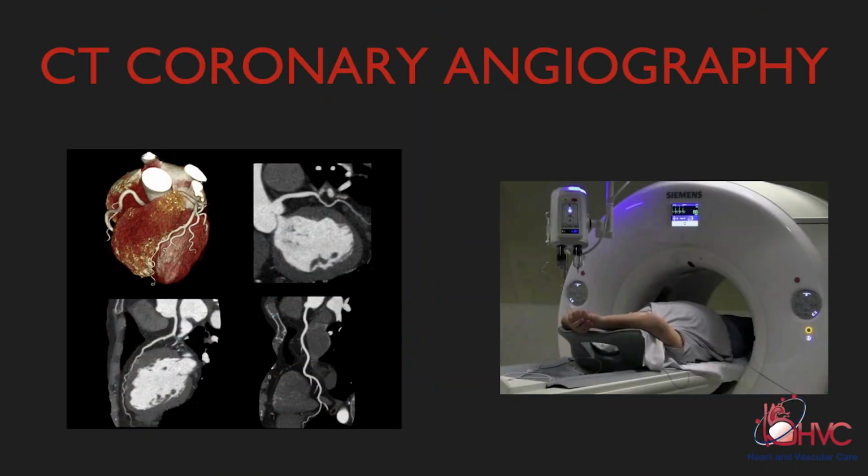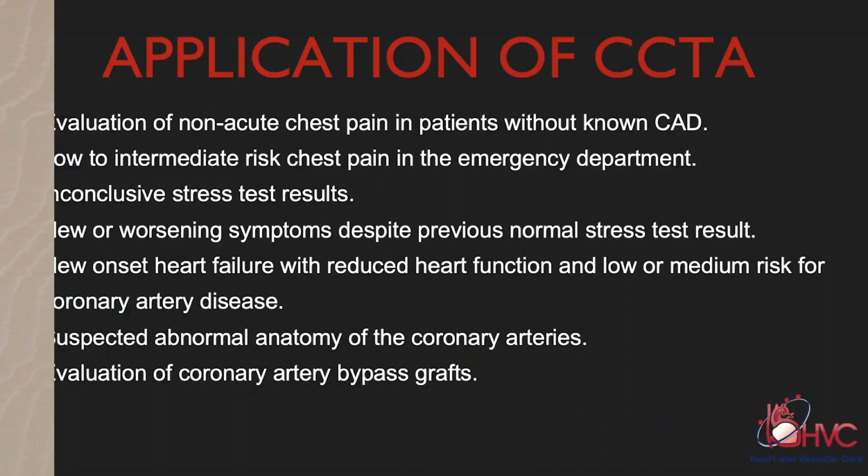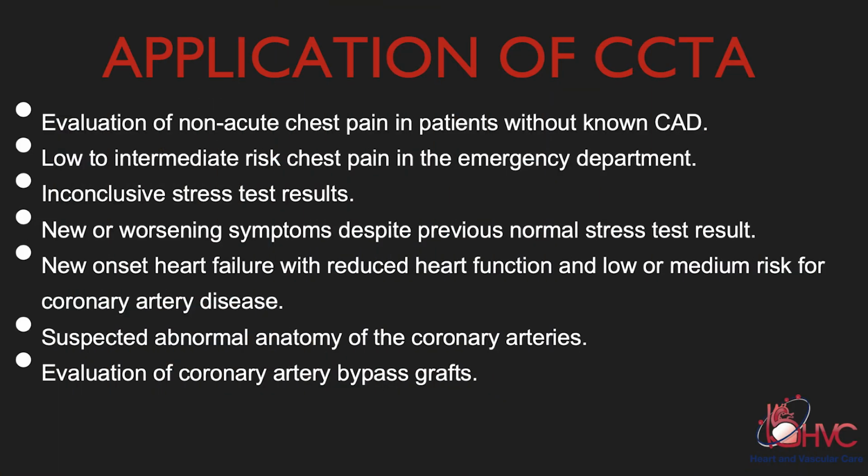So we'll go on to seeing how CT coronary angiography can add to that. This is another diagnostic tool in our toolbox while we're trying to determine what is my patient's risk. So CT is a most non-invasive way to evaluate coronary artery disease. It is particularly helpful in a patient who has non-acute chest pain and no history of CAD. They've got some risk factors and their symptoms are definitely making you concerned. CT can actually be your first line to evaluate what's causing my patient's symptoms.